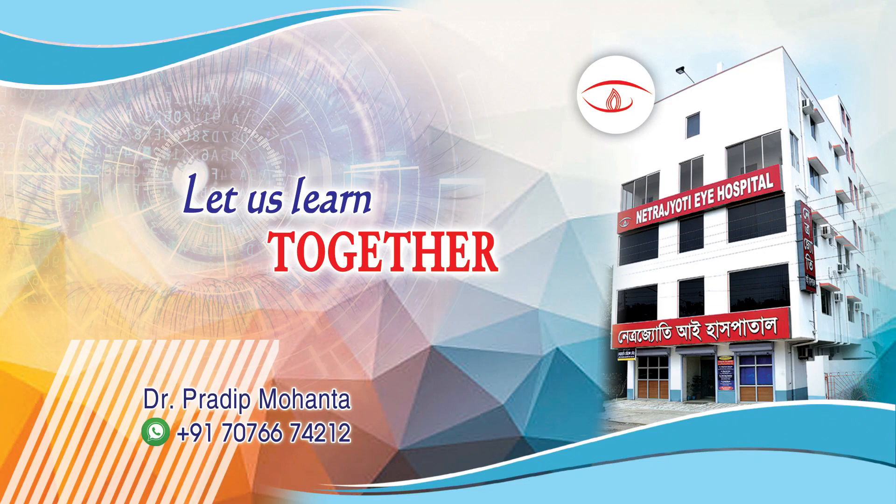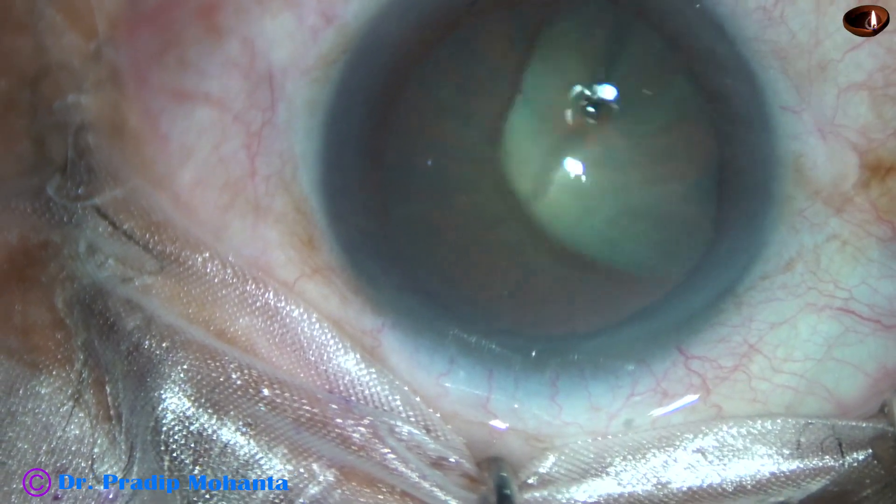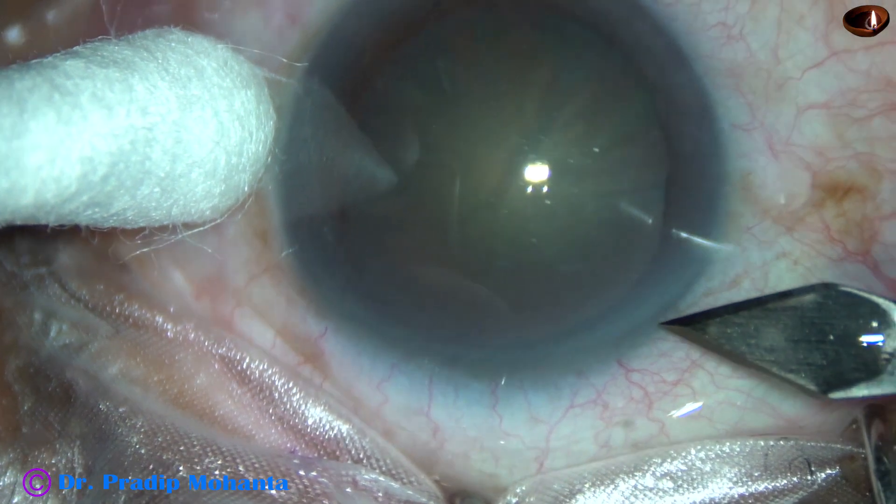Friends, welcome to my workpiece at Ranaghat, West Bengal, India. This is a cataract with grade 3 nuclear sclerosis. Let us observe this surgery.